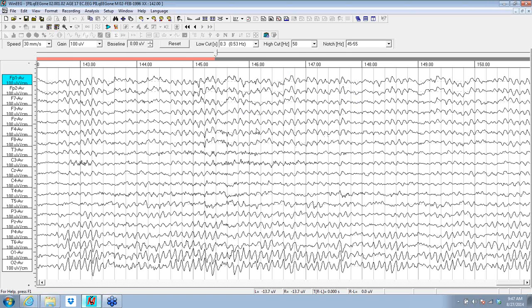If it's from the FZ area, anterior cingulate, then it means you've got a cingulate issue. So figuring out the source of this ends up being really important, not just casually asking what's making this alpha up front, because it changes what you're going to see it as clinically and whether you want to intervene on it up front as a frontal lobe disturbance or not.